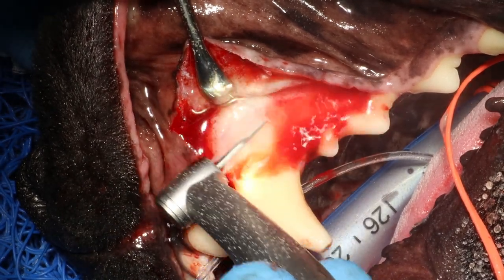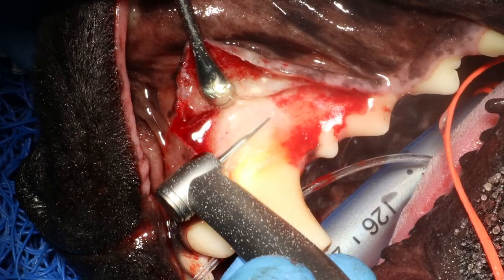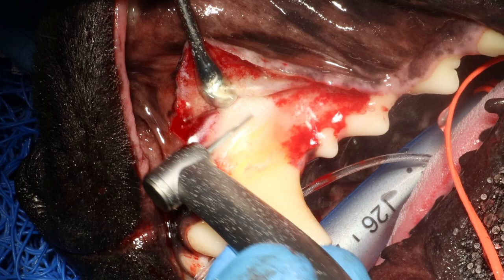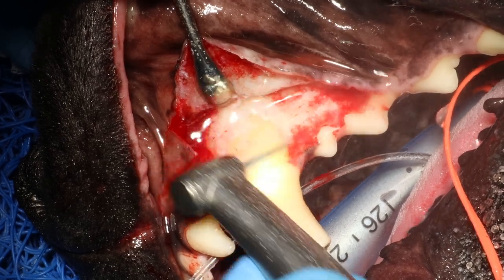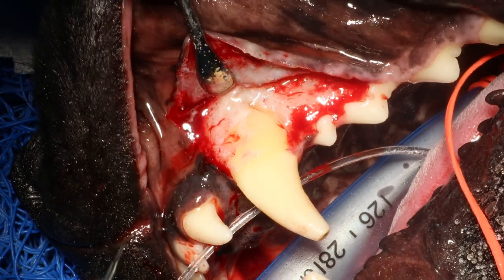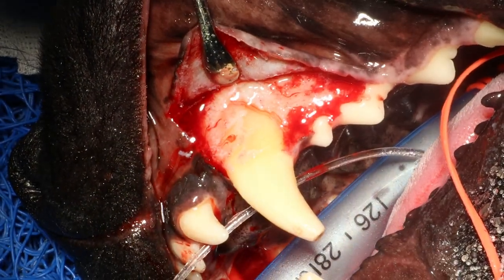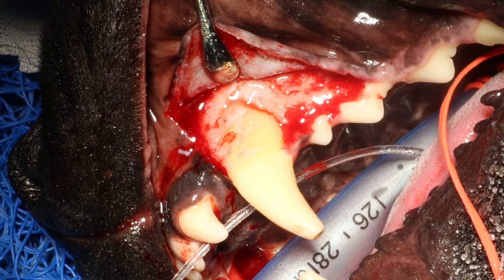You get much more surface area out of this burr so you can remove bone more quickly. I also like to create some grooves in front and behind this tooth — mesial and distal to this tooth root — and I will show you that in a little bit.